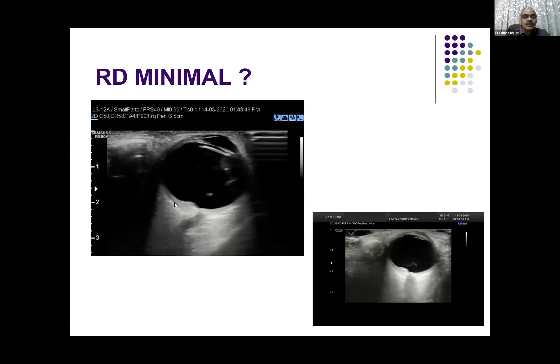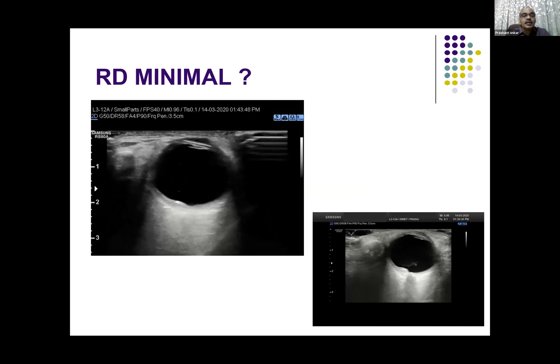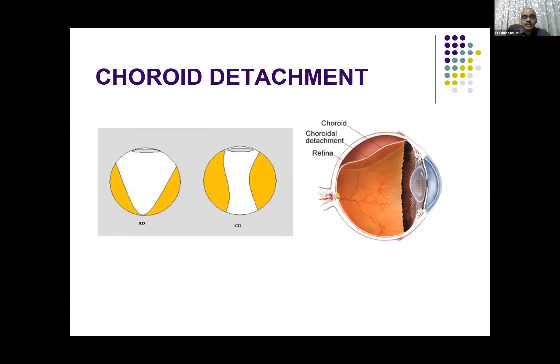This is a very minimal separation — not exactly separation, but the retina is just beginning to — you can see it is edema, or it is just beginning to separate. This also you can identify on B-scan or high resolution ultrasound very easily.